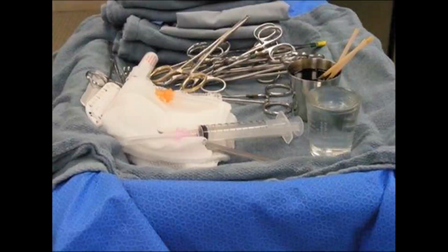One benefit of dry heat over moist heat sterilization is that certain surgical instruments become dull, lose their luster, or may gather rust in moist heat sterilization. These types of problems are not faced during dry heat sterilization.